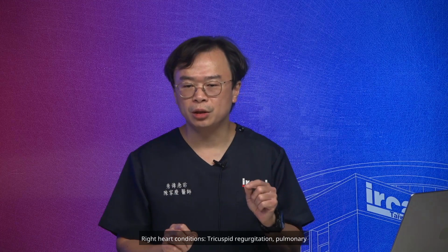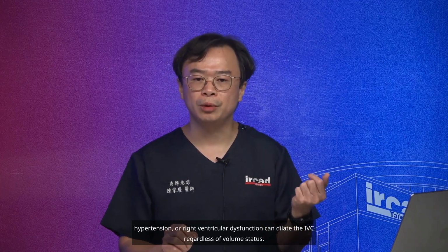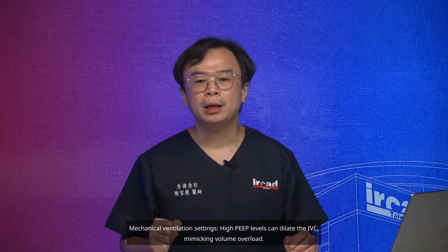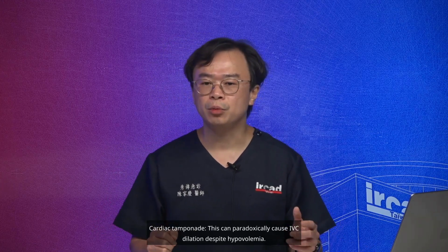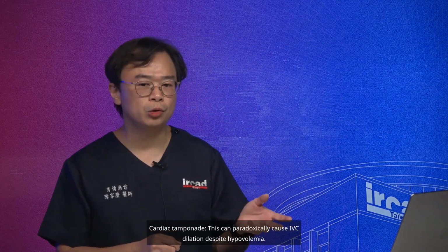Right heart conditions. Tricuspid regurgitation, pulmonary hypertension, or right ventricular dysfunction can dilate the IVC regardless of volume status. Mechanical ventilation settings. High PEEP levels can dilate the IVC, mimicking volume overload. Cardiac tamponade. This can paradoxically cause IVC dilation despite hypovolemia.